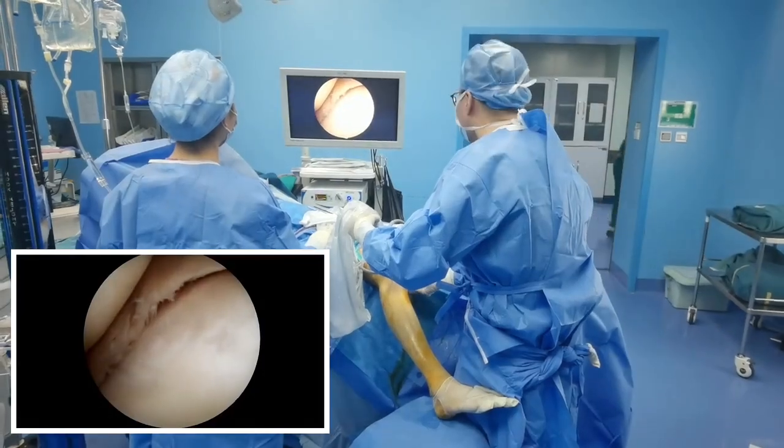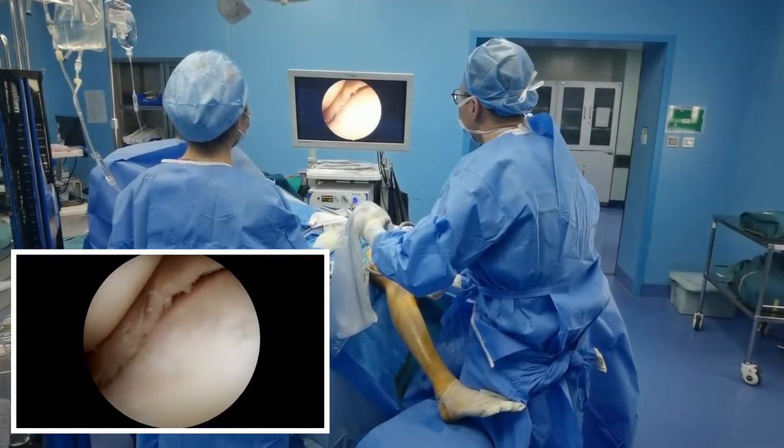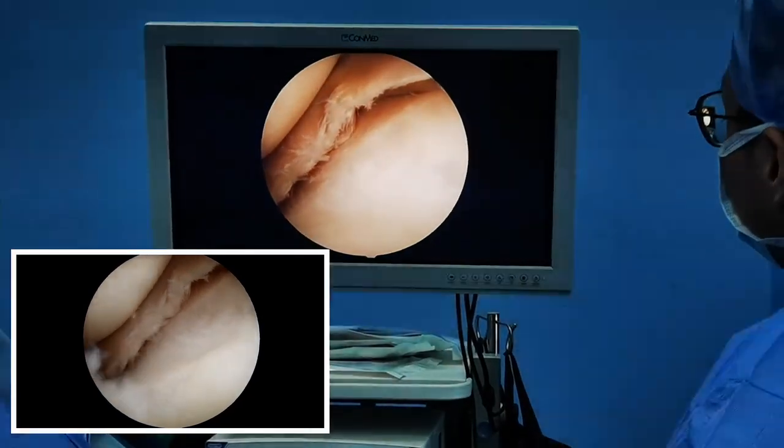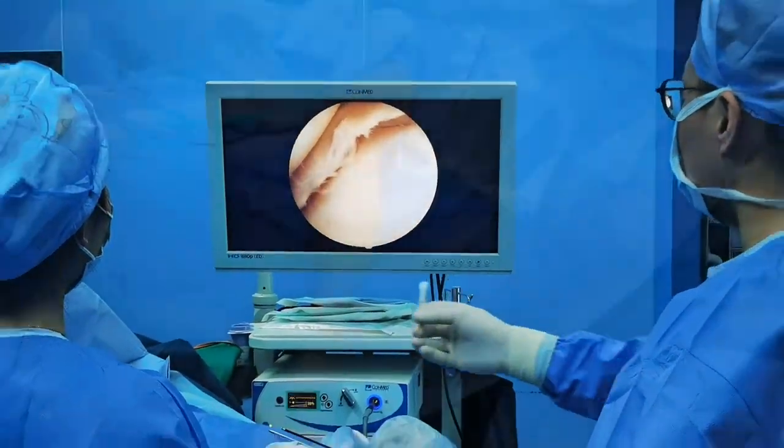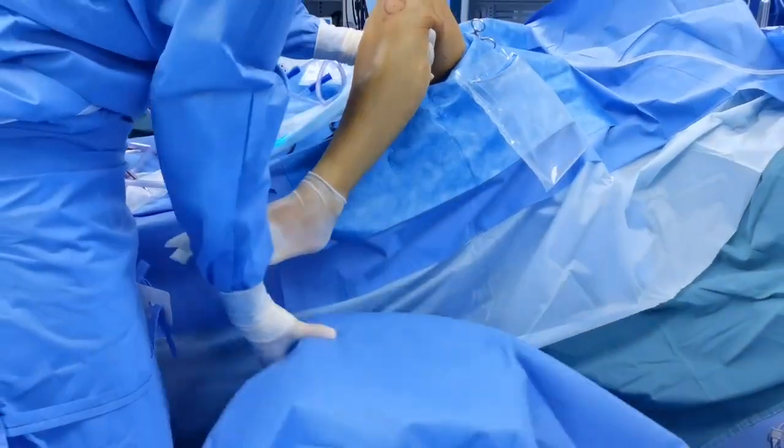Here we demonstrate the pie-crusting technique without assistance. In our experience, even for a solo surgeon, the metal round stool provides a reliable and stable auxiliary role, and the operating surgeon can perform the technique in a more comfortable position with this setup.